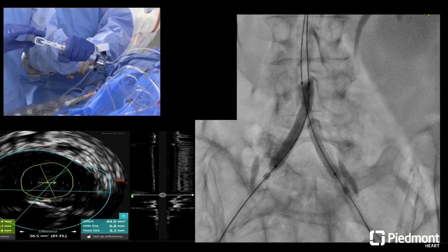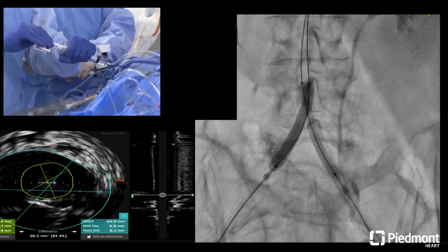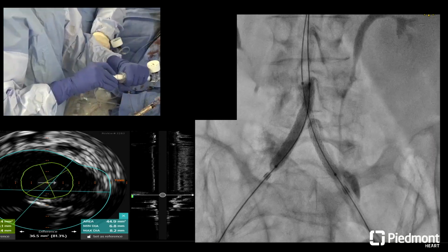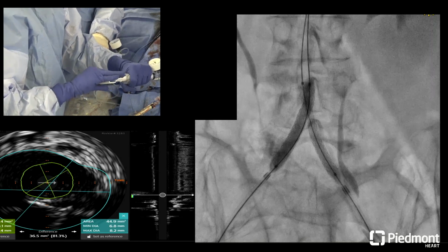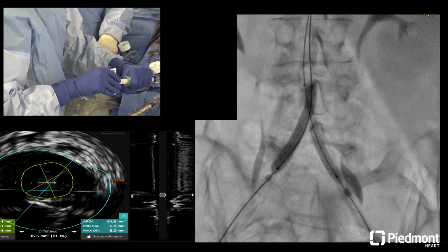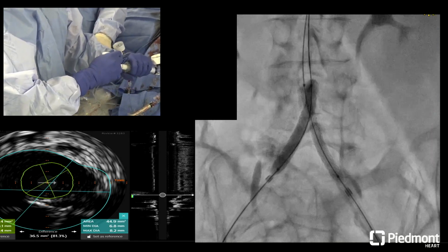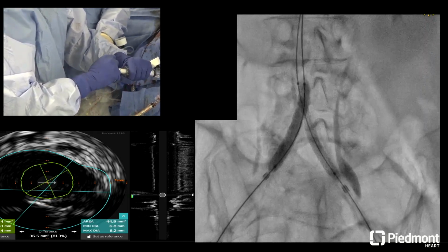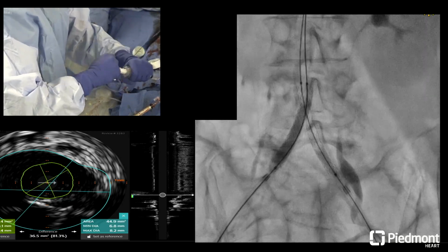All right, 8. And I like to go slow on this. I think our tendency, especially in the corners, is to speed up going to 10. I really like to go real slow in this aortic stuff. I don't like anything blowing up. Should we come down? Let's hold it at 10. 3, 2, 1, down. We made it to 10.